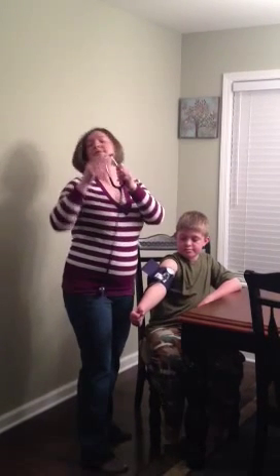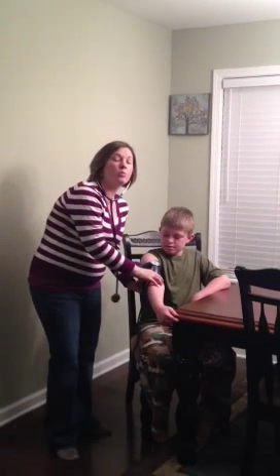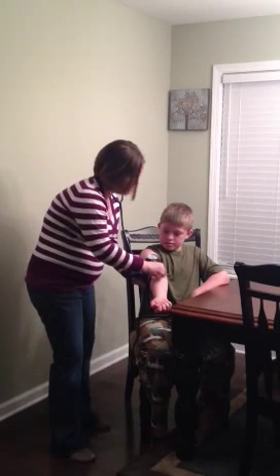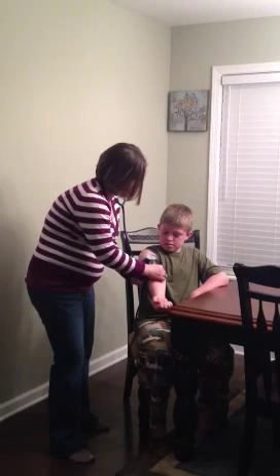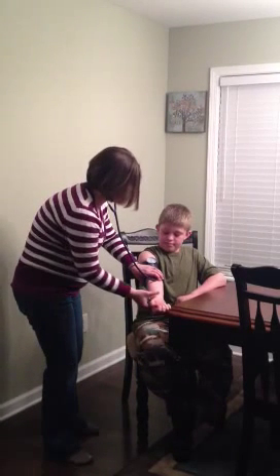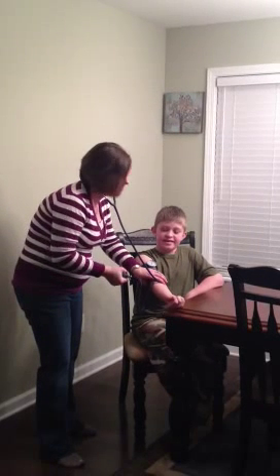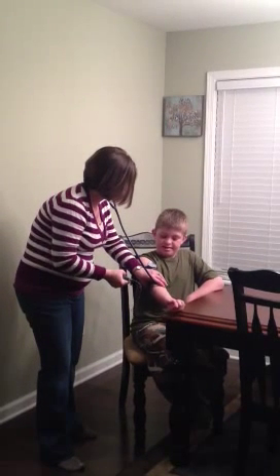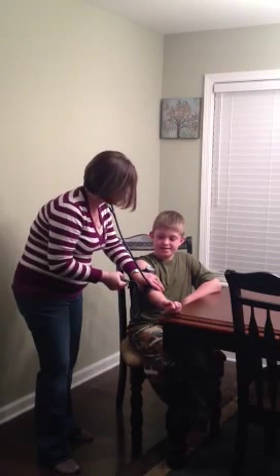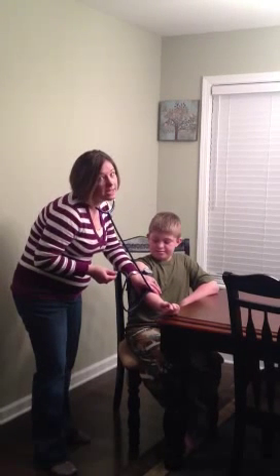Okay, and I'm going to use my stethoscope and place it right on the brachial artery, right on the inside of his arm, so I can listen to the heartbeat as I pump it up. Hold your arm right there, please. Thank you. And we're just going to pump it up. For a child, I usually pump it up to about 140. Then we let it out slowly.